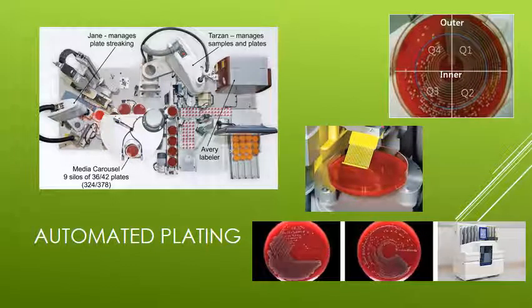Now, some of the other really fancy things that are coming out are automated plating systems, and I think you need to know what these look like. The key thing being, look here, the difference. This is our standard quad plate right here, and this is a specimen that's been plated by a machine. Okay, and you can see they don't look the same. What's the difference between the two?